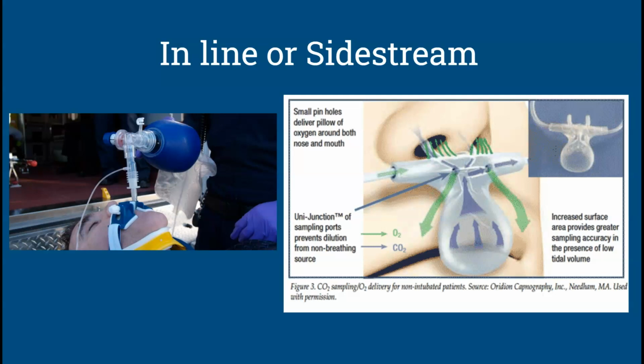I've done some definitely wild and crazy things where I've taken the end tidal part of this and put it right next to the patient's mouth, for those who weren't using a nasal cannula, they were using like a non-rebreather. It works occasionally. It's not as effective as you would think, unfortunately. But you can also have a patient, it's going to sound completely ridiculous, blow right into this, into the inline, and it will work. It will give you a reading.